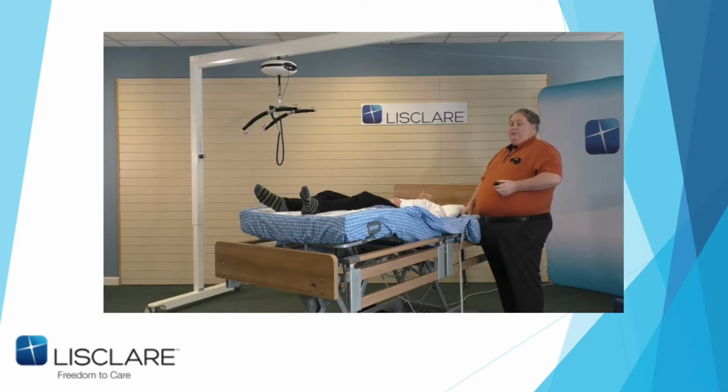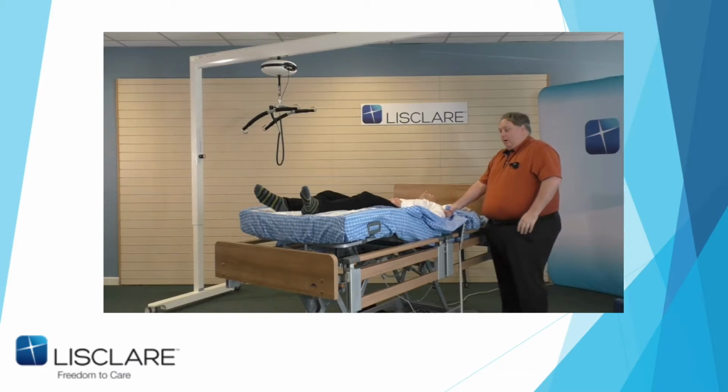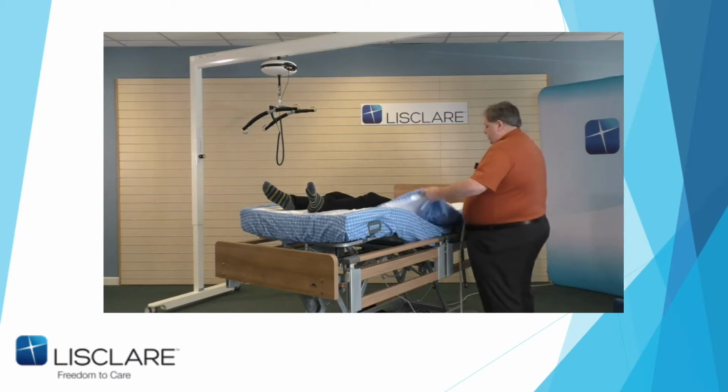And he taught me something at the Scottish Manual Handling Forum. He was asked during the question time with the trainers, well, what happens if the carer has arthritis in their hands? How do they grasp the sheet? And Irv was obviously prepared for it without telling me. Out came a squash ball out of his pocket, goes into the sheet. You can grab here, and it means you don't have to grasp as hard. Again, I get into that position and lean back, and up becomes the bed. Especially bought for this afternoon. Thank goodness the sports shop beside is open.